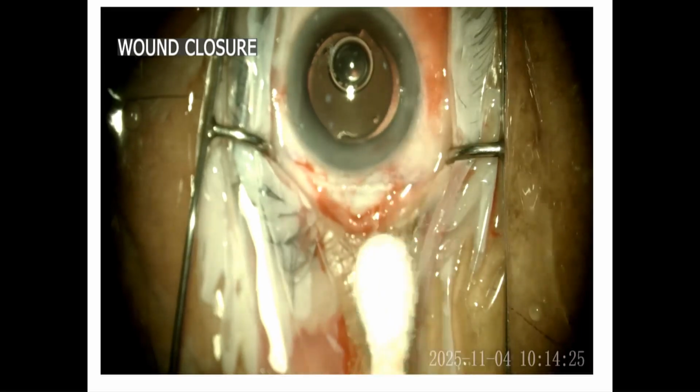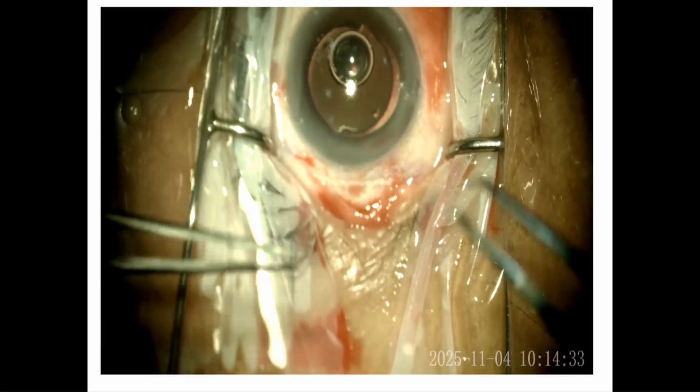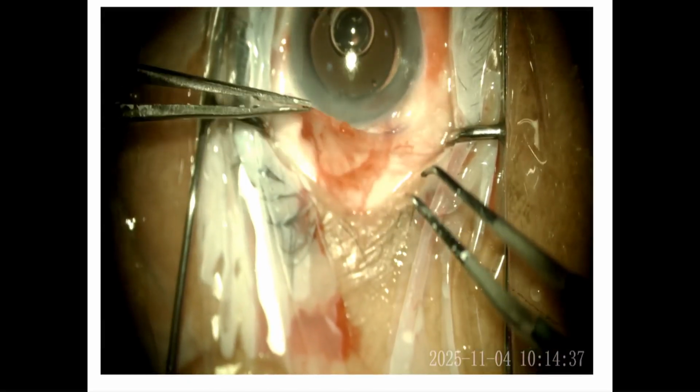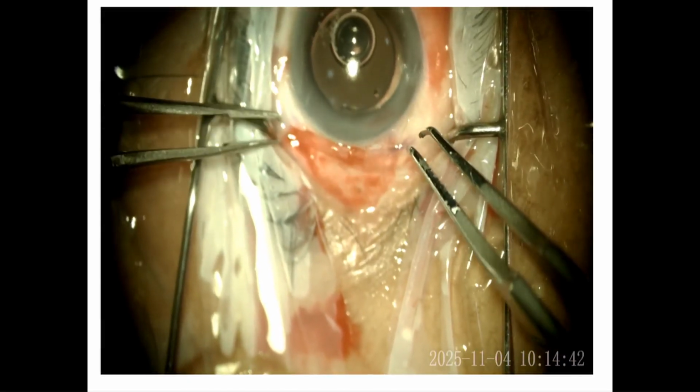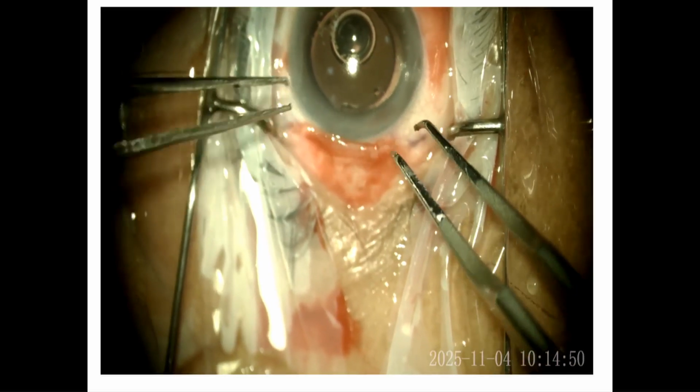All right, once you have made sure, if you have any doubt, you have to suture, or else if there is no leak, you can just retract the conjunctiva over and place gentle cautery. So that's about the steps of SICS.